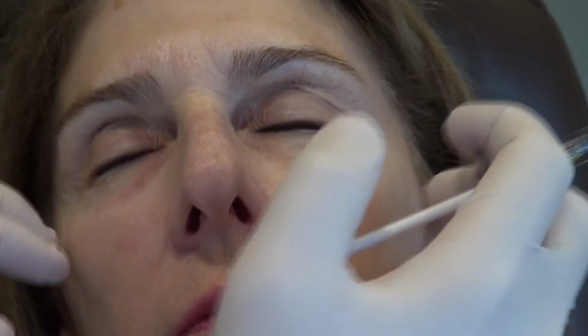Okay, so we already have very good progress. We have a nice fill here. Let's go over here a little bit.